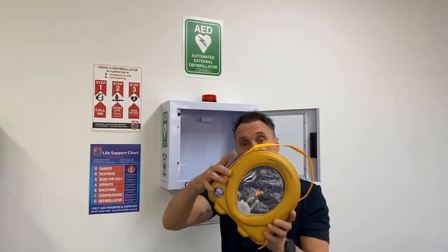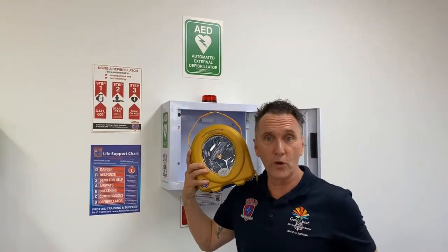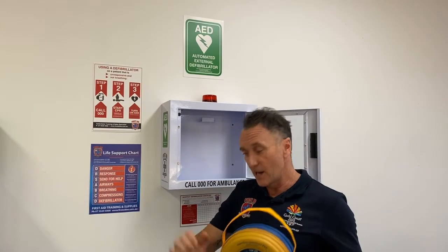And of course, we have the HeartSign 500p smart defibrillator. This smart defibrillator is a great addition for any workplace because it teaches the first responder how to do CPR — it's like having a paramedic right on your shoulder. If you're doing CPR too fast, this defibrillator will slow you down; if you're going too slow, it will speed you up, giving you real-time feedback all about blood flow to the head.